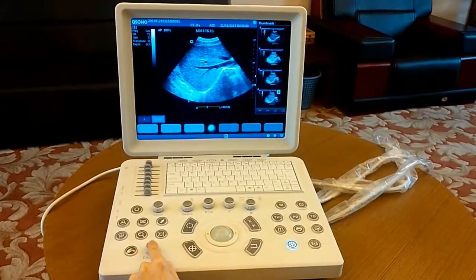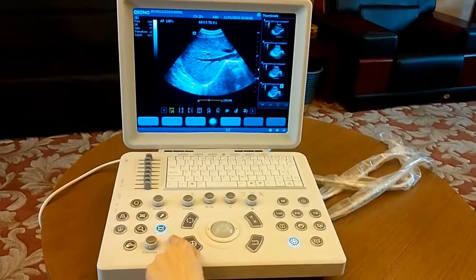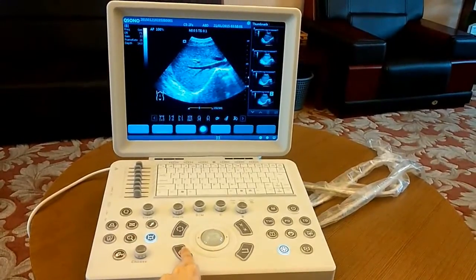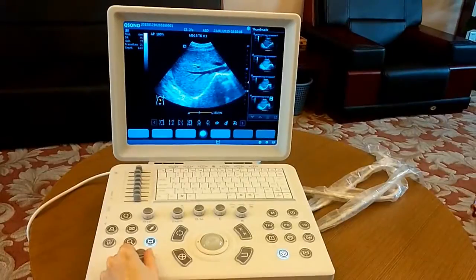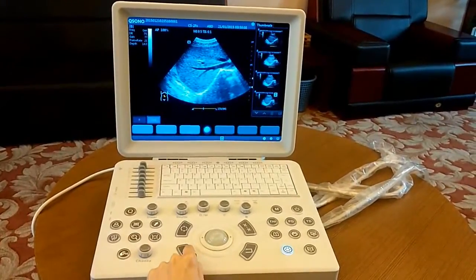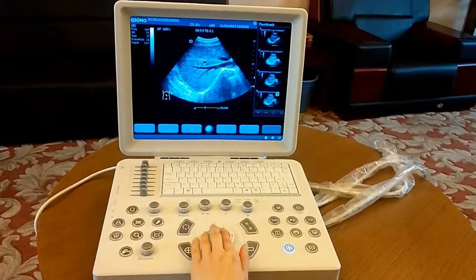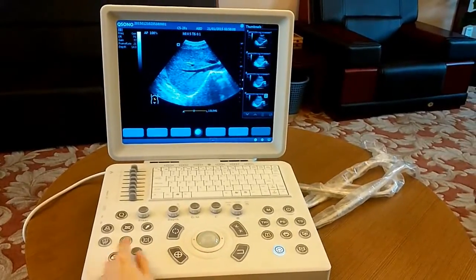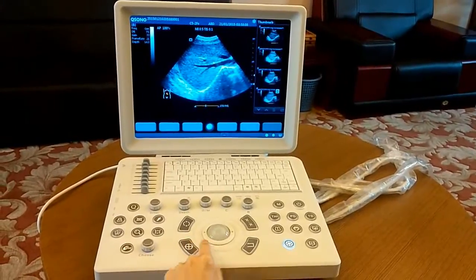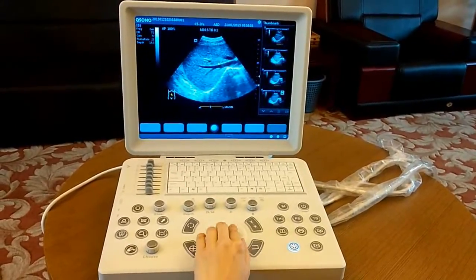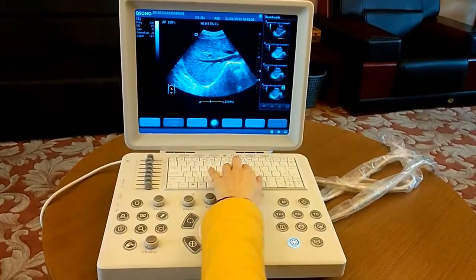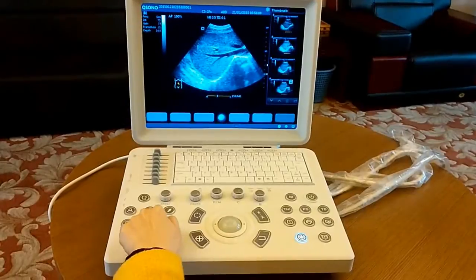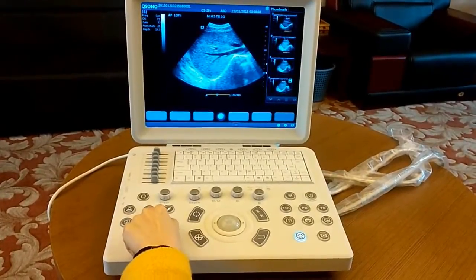You can add body marks, arrows, and text on the image. Press the trackball button to release the cursor in freeze status. Press the body mark button — many body marks will appear on the screen. Select one and rotate the knob to change the direction of the probe mark, then press set to confirm. To add text on the image, move the cursor to the desired location and input text. If you want to erase annotations, press the clear button and they will all disappear.